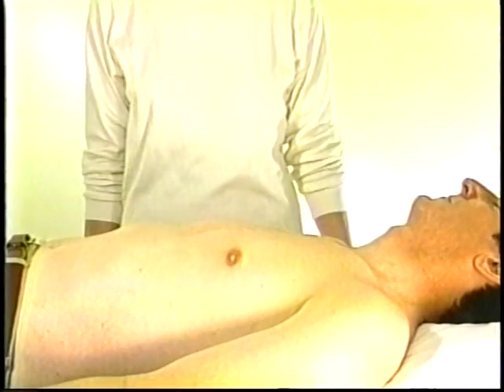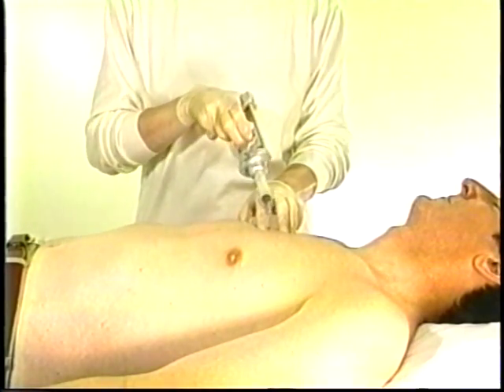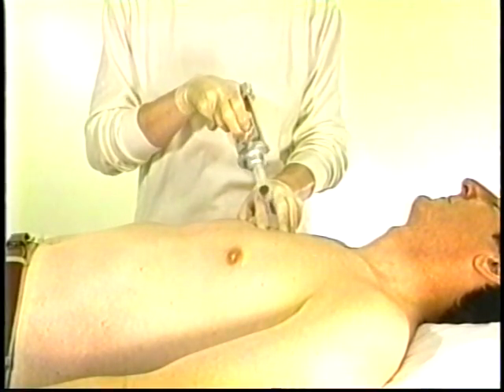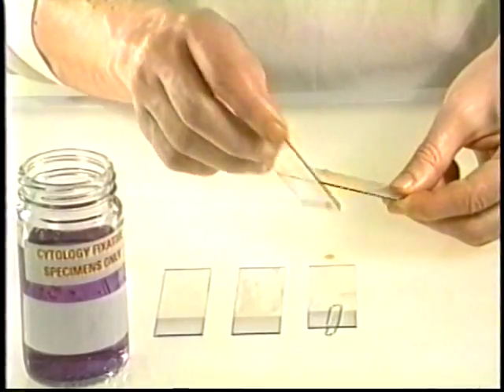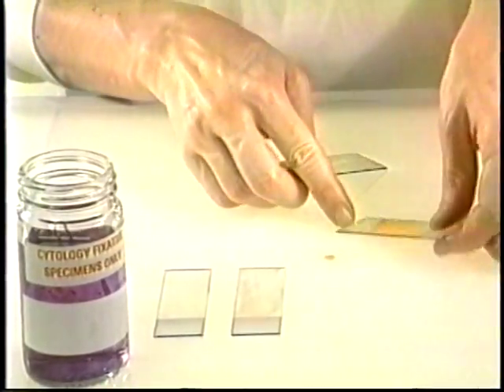I always do a second sample of any one target in order to ensure enough material and also to sample more than one area in a large target. The second sample is more likely to contain blood than the first one. This is because of the trauma of the first sampling. In this case, the second sample contains a fair amount of blood. Here, I use a combination of the first two concentration techniques described earlier.